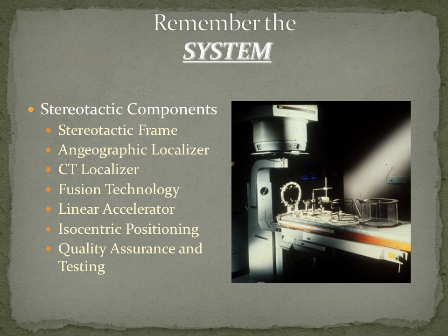In order to do this, this is what we spend a lot of our time on: making sure that everything from the localizers through all the targeting systems are aligned and actually do give you the same answer. And we can hold this tolerance within a few tenths of a millimeter.